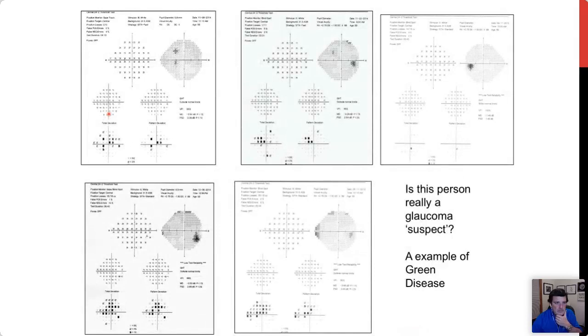And we look at his visual fields that have been collected and reviewed by different people over several years. We can see that there is a corresponding functional abnormality, but the left eye, which was more suspicious on OCT, really was actually normal. We can advance, Greg.